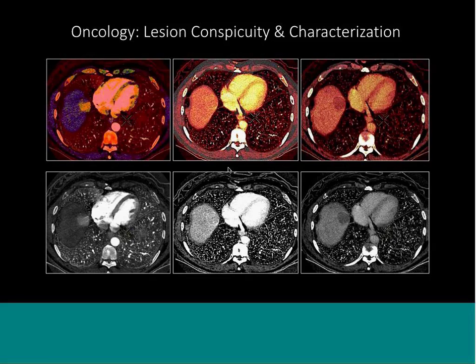And by the way, what you call and what you detect has implications for whether or not it's truly an HCC. If you just look, yes, clearly there's arterial enhancement. Yes, clearly there's a rim of enhancement, that's the capsule. And yes, clearly there's washout, i.e. it's darker than the adjacent hepatic parenchyma. In 3 seconds, I can tell this referring physician and patient, this is without a doubt 100% hepatocellular carcinoma, okay?